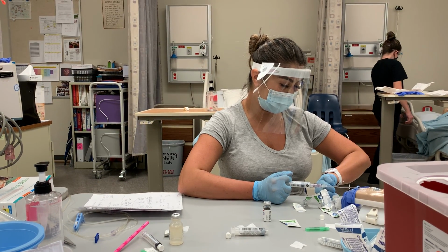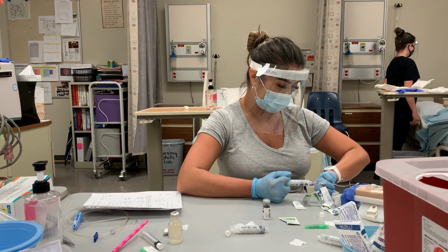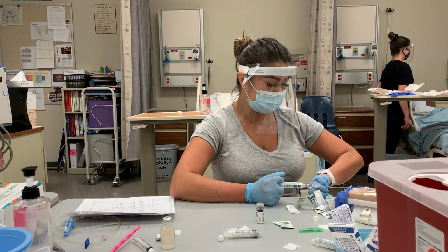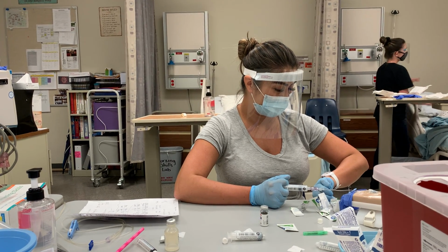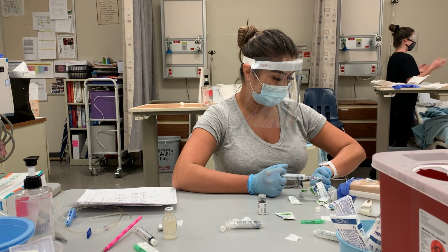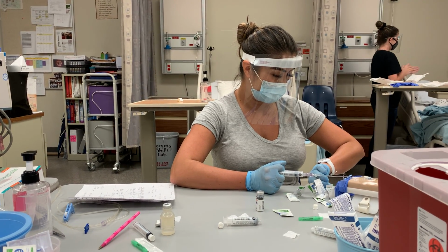At least 30 degrees. Make sure the call light is within reach, and check the site. Then I will do hand hygiene and leave the room.